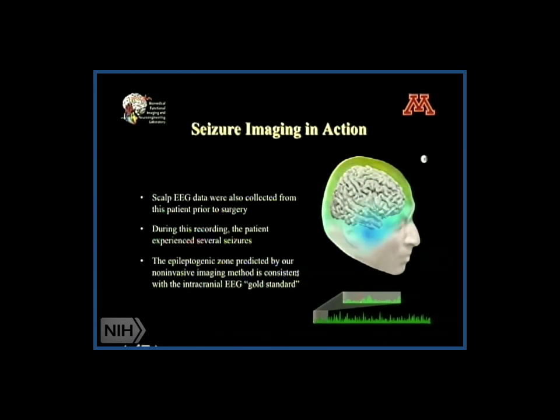This video should give you a visual impression of how this seizure imaging works. You can see the seizure EEG being recorded, and the power of the seizure EEG at one electrode over the entire scalp. The key message is that looking at scalp EEG alone does not have good spatial resolution. However, if you solve this source imaging problem, the source activity can be estimated spontaneously over the seizure progression in regions validated using invasive ECOG recording. Through significant engineering work, these low-resolution EEG recordings can be turned into high-resolution source imaging that provides pathological information in the human brain.